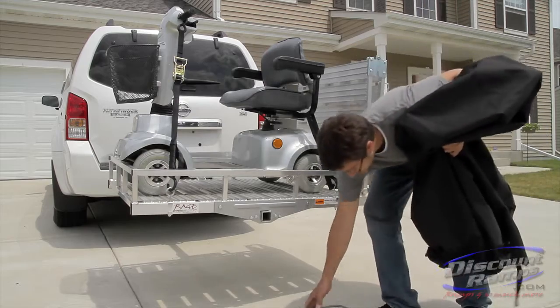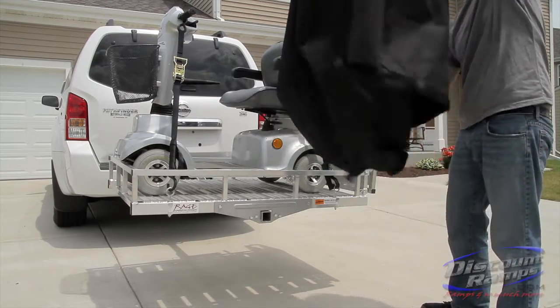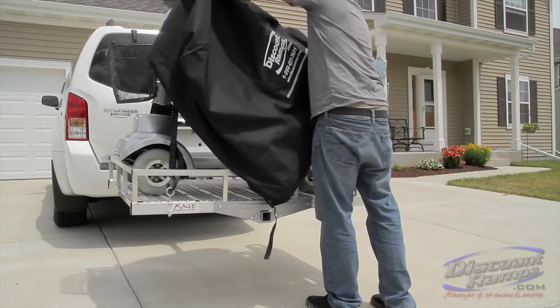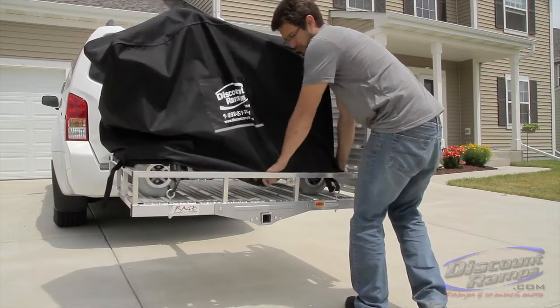Optional heavy-duty mobility covers protect your scooter from sun, rain, and debris while being transported. The cover easily attaches to the carrier using bungee cords. Bungee cords and cover are not included with the carrier.